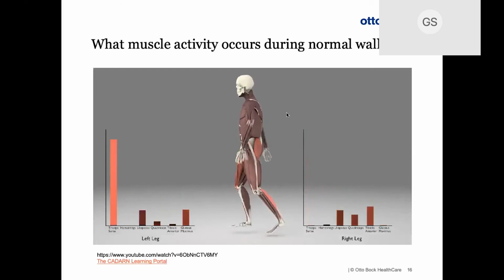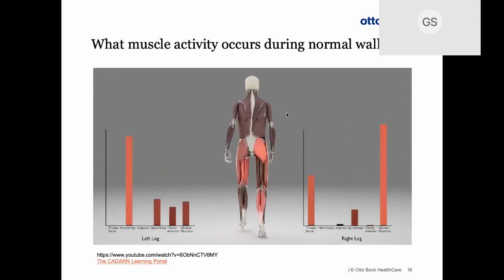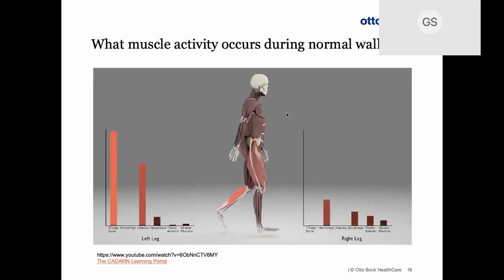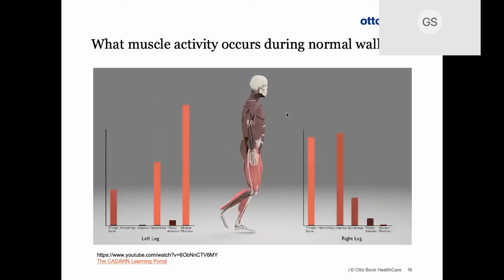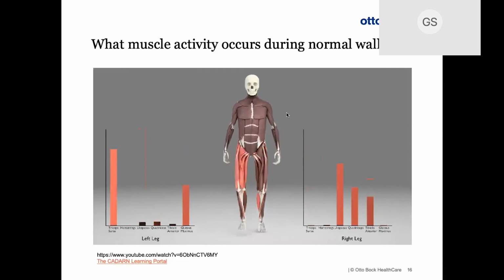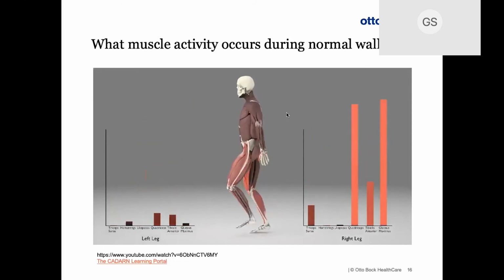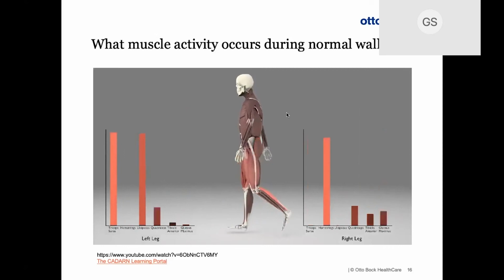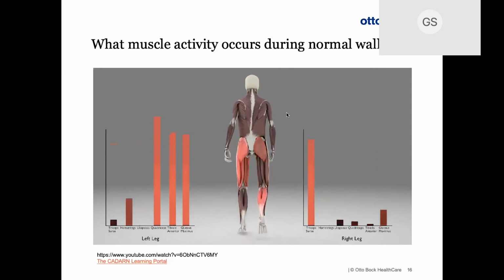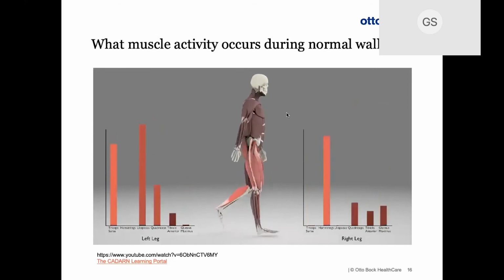So this is really what we're talking about in terms of a custom carbon AFO or carbon ankle: how can we help that triceps surae if it's weakened or lowered in terms of muscular activity, how could we enhance that so the gluteus maximus doesn't have to work as hard, and we can prolong the amount of time spent in single leg support so we can actually protect the other limb. That's an important part of what we do as prosthetists and orthotists. We're not only providing greater mobility for the limb we're dealing with, we're actually providing protection for the contralateral limb as it goes into heel strike.